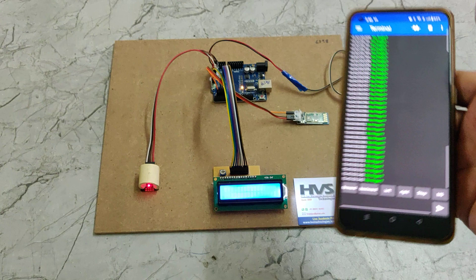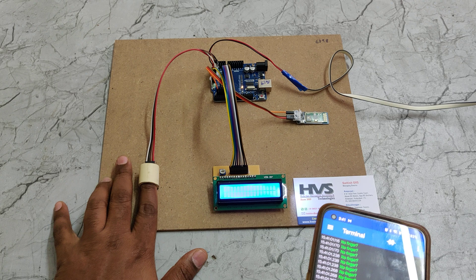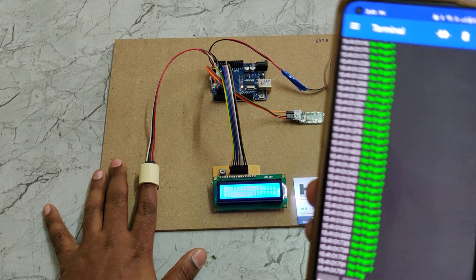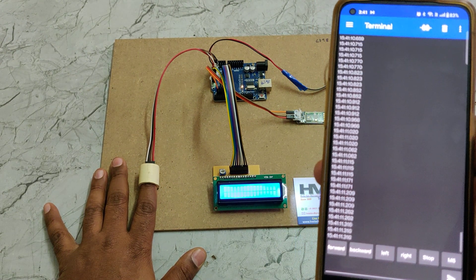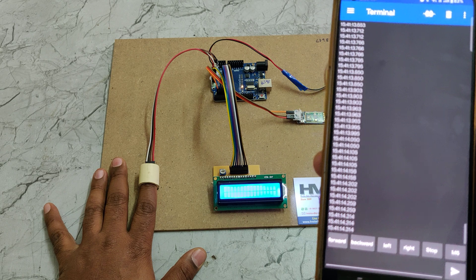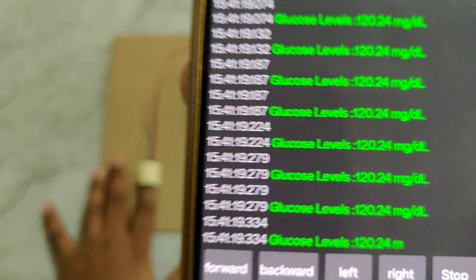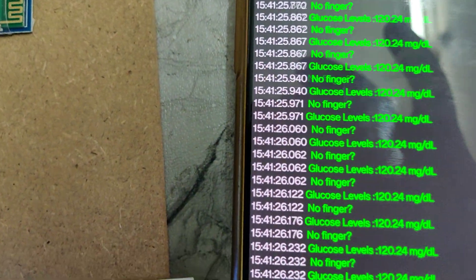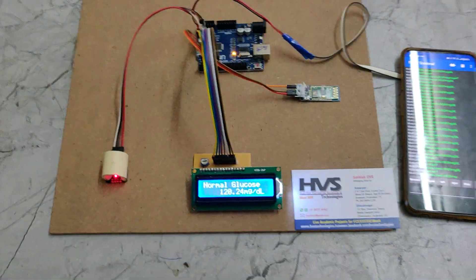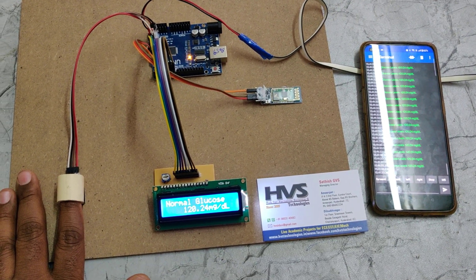Once connected, the app will show 'no finger' when no finger is placed. Once you place your finger on the sensor — no need to press hard, just press normally — the 'no finger' message goes away and you will get the blood glucose values after a short wait. The green values are the blood glucose levels, received continuously on both the LCD screen and your mobile phone screen.